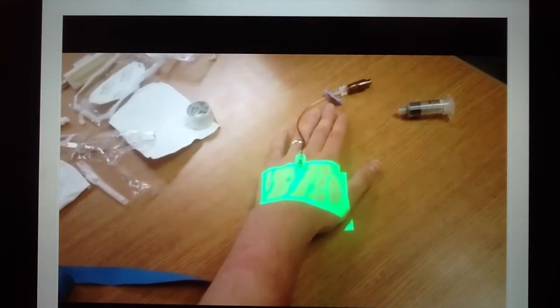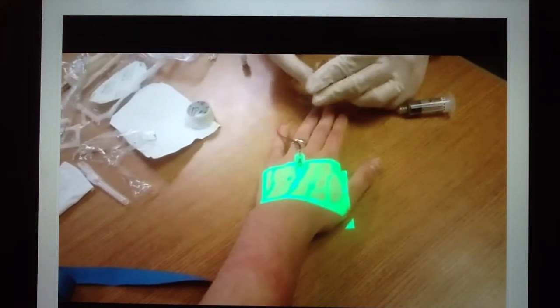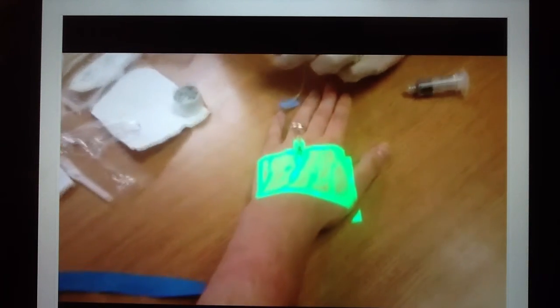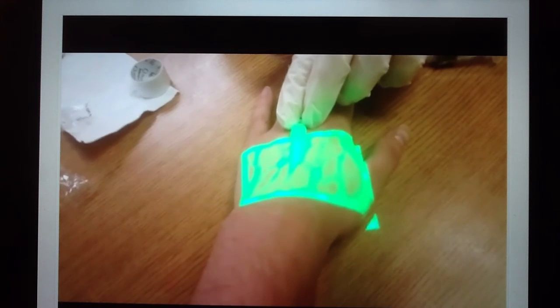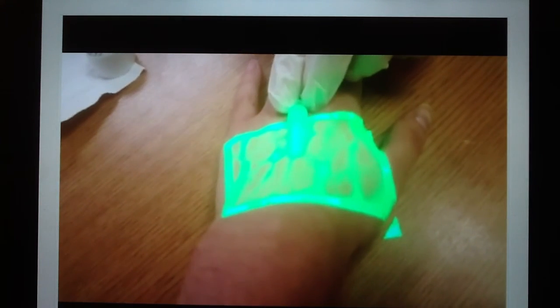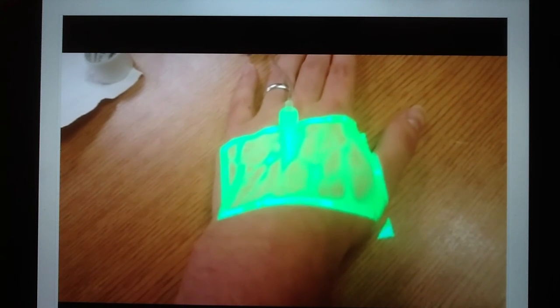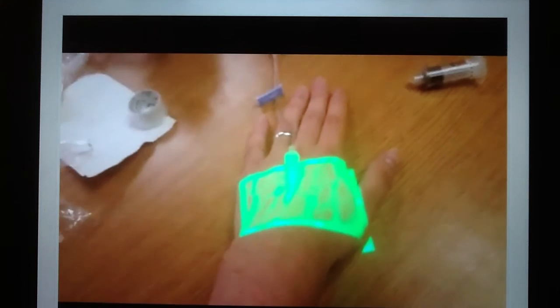I wanted to further check the patency, so I attached a 10 milliliter normal saline syringe to the end of the hub and flushed. If you look closely, you will see the near-infrared light disappears at the top of the patient's wrist, which just further demonstrates good patency. Once good patency is shown, you can secure it to the patient's wrist, and now the intravenous device is ready to be used for IV antibiotics or IV hydration.